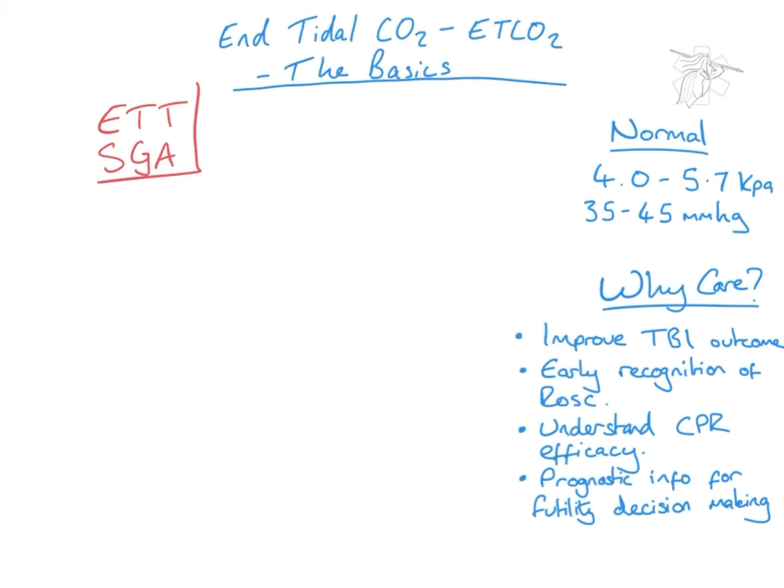an iGel. Now these devices then will attach to a monitor of some kind, either a large combination monitor with a defibrillator such as a Corpuls or a LIFEPAK or a ZOLL, or it might actually be a standalone device such as EMMA. Either way, it'll take the measurement in one of two ways. It'll either suck some of the air out of your airway setup and sample it with a measurement device, or it'll use an infrared sensor to measure CO2 in your airway circuit.